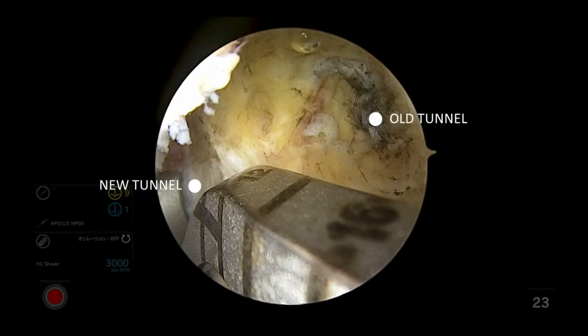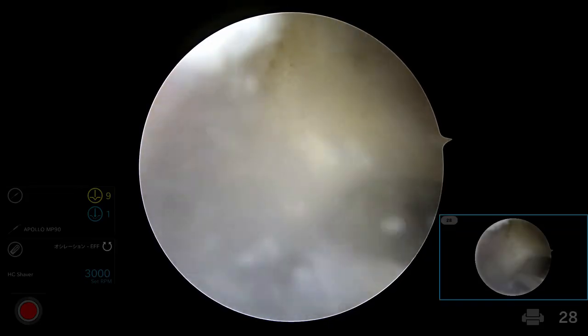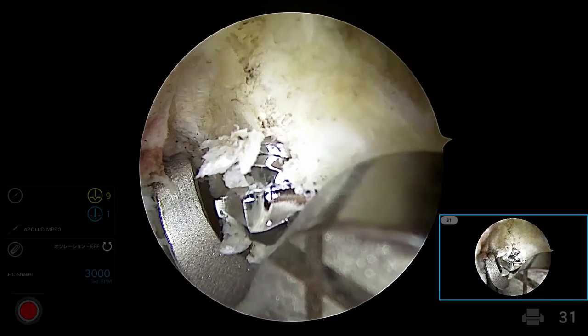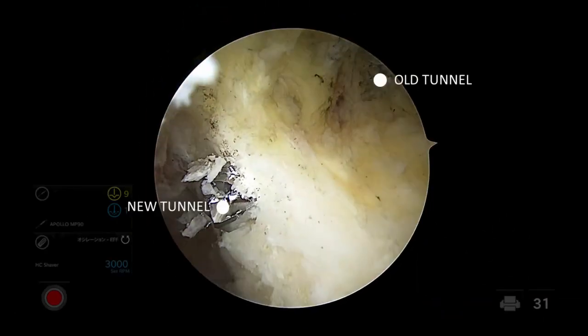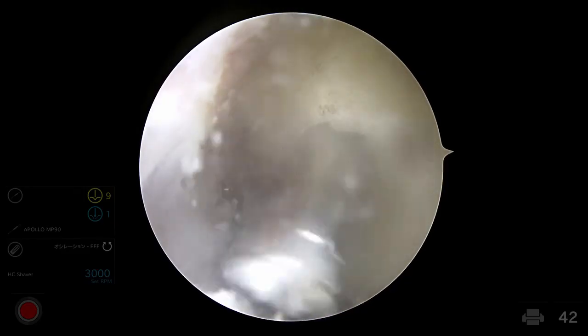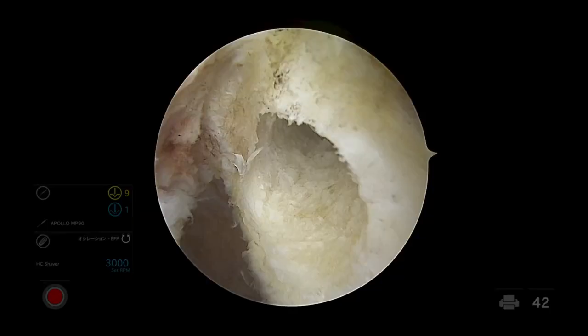The drill sleeve is inserted 60 degrees to a line perpendicular to the femoral anatomic axis and 20 degrees to the transepicondylar axis, and a 3.5 mm flip cutter is then passed from the lateral cortex of the femur towards the lateral wall of the intercondylar notch, ensuring that it is exiting at the right point. Once inside the joint, the flip cutter is opened and a larger diameter tunnel is reamed in a retrograde fashion. This now produces the initial hole.